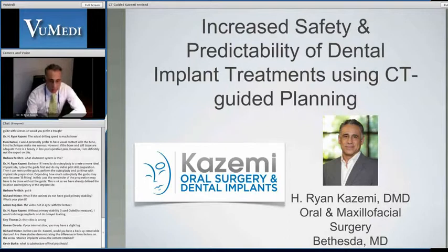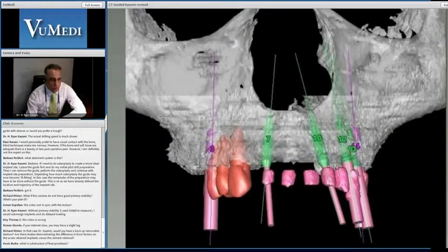So CT-guided planning, as we talked about, is nothing really new. It's been in practice for several years. And what I hope to focus on the next 20 minutes is really discussing some experiences of how we can make our treatments safer and more predictable.